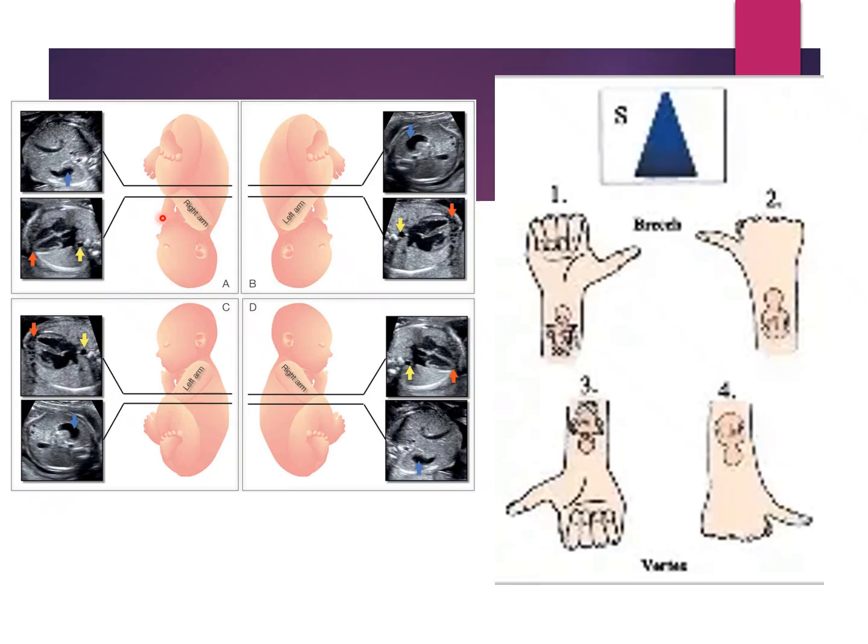Now, that would be maternal right, okay? Thinking about how mom is lying here. This is mom's right side, this is mom's left side. So this baby is cephalic, maternal right. In the next case, we're going to find our structures again, right?